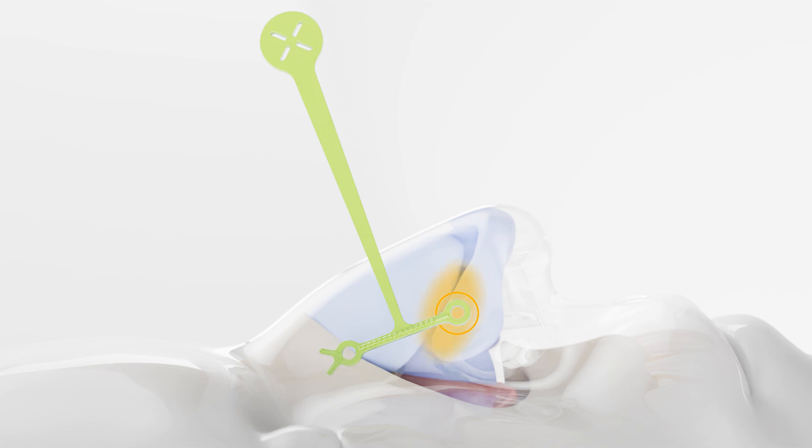Maintain the pivot point and pivot the forks laterally on the maxilla. Once satisfied with the placement, mark the forks, the atraumatic tip, and then a third point on the ala for the pierce point.